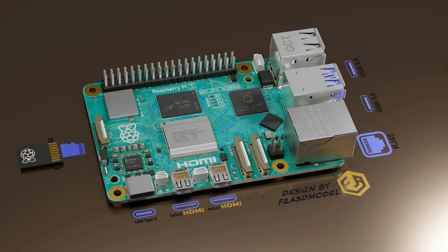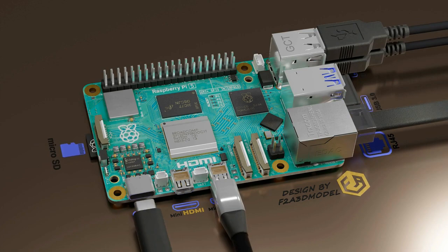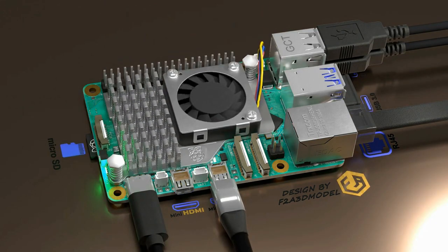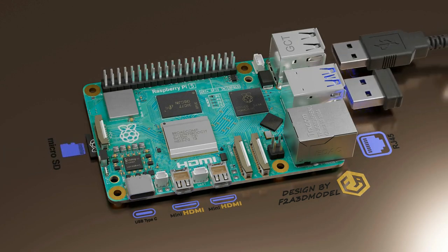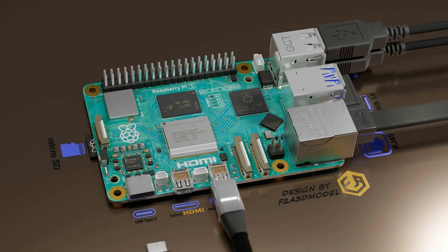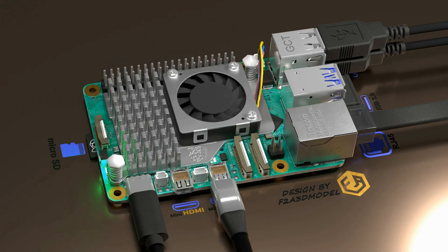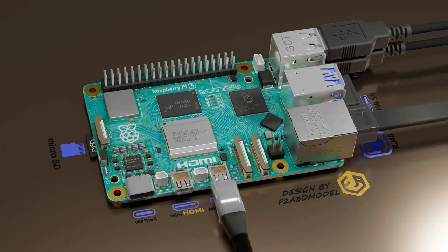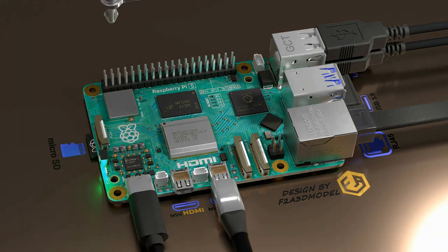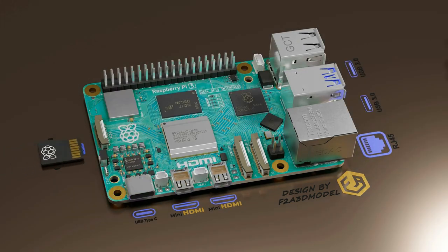The core of our prototype is the Raspberry Pi 5. It acts as the central processing unit, managing data from the thermal camera and handling image capture in real time. The Raspberry Pi 5 processes temperature data, overlays it onto a visual display, and stores it locally or streams it to an external device. Its speed and compact design make it ideal for portable, low-power applications like ours, bringing reliable performance to our thermal imaging system.